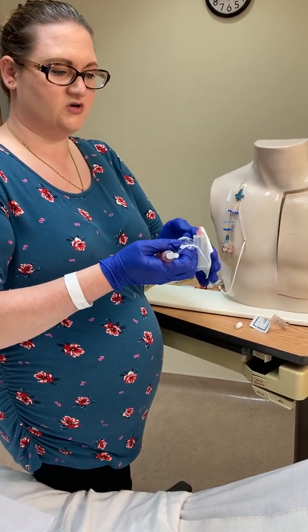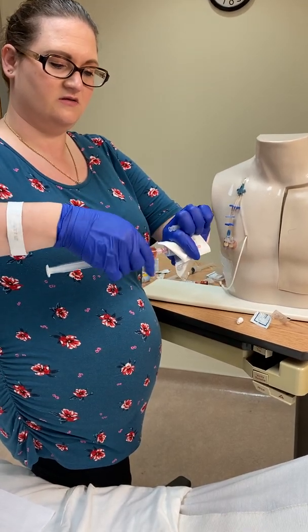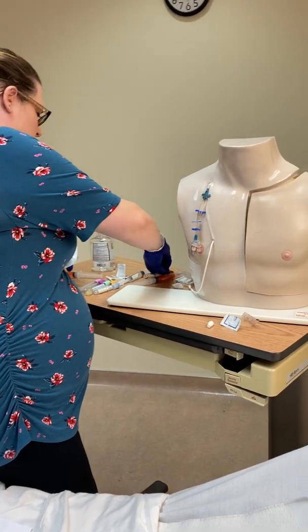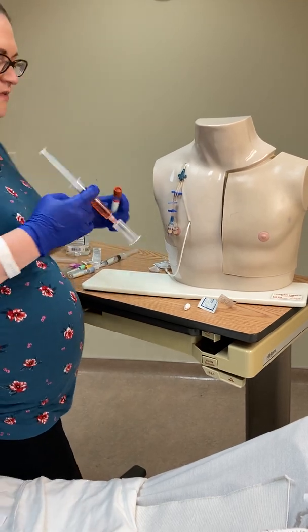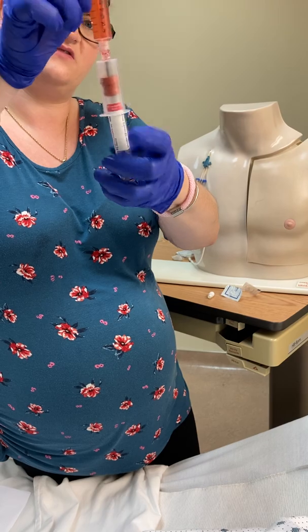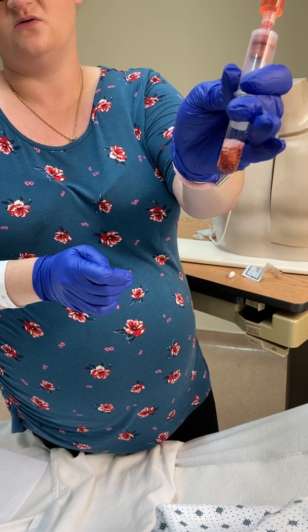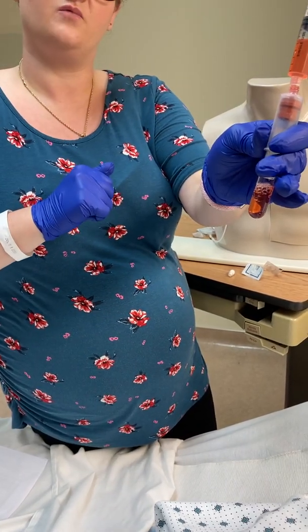Get your blood transfer device ready and set the test tube nearby. Transfer the blood using the vacutainer — the vacuum will pull the blood down into the tube on its own, and it will stop filling once the negative pressure is gone.